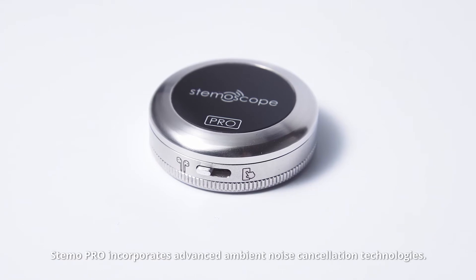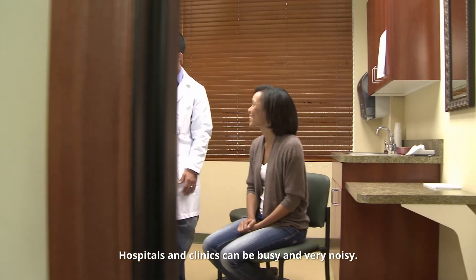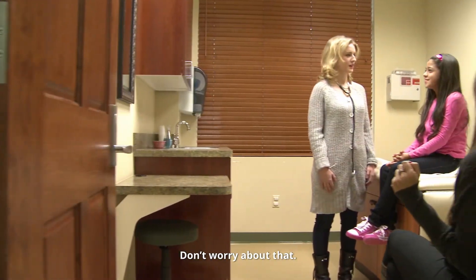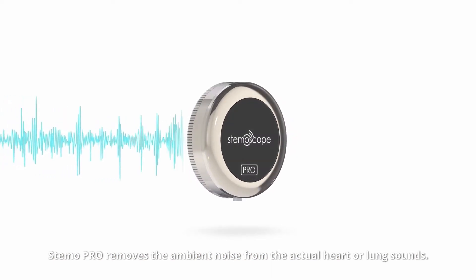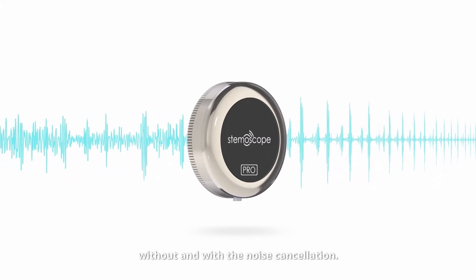Stemo Pro incorporates advanced ambient noise cancellation technologies. Hospitals and clinics can be busy and very noisy — don't worry about that. Stemo Pro removes the ambient noise from the actual heart or lung sounds. Let's listen to some samples recorded without and with the noise cancellation.